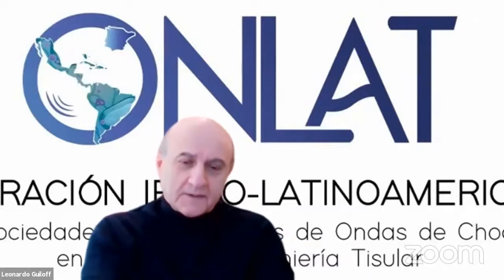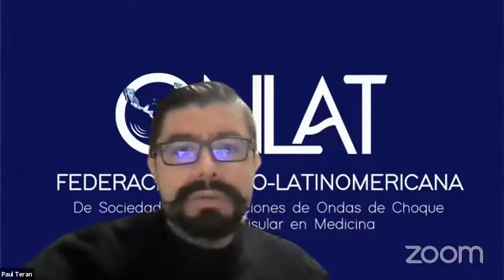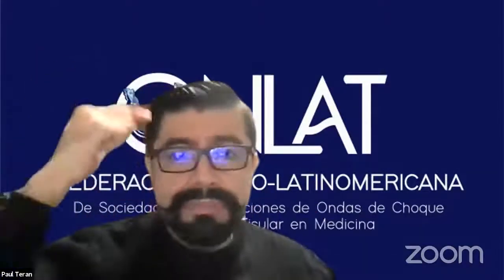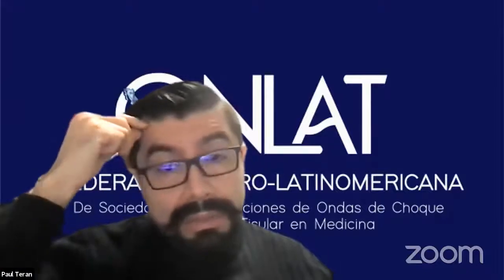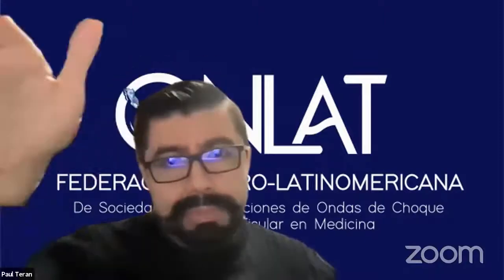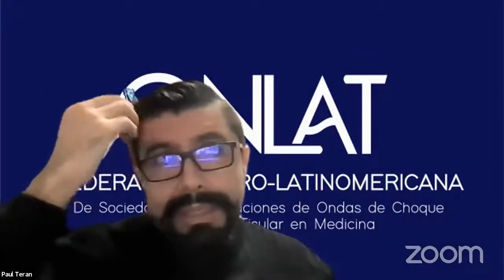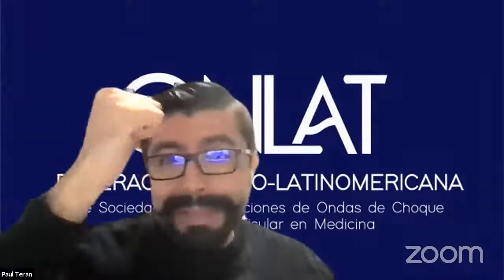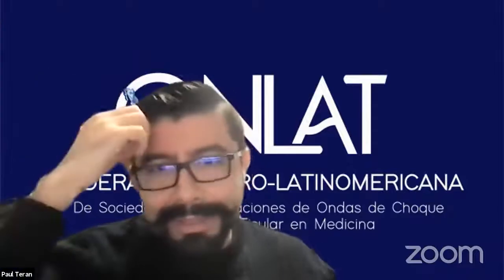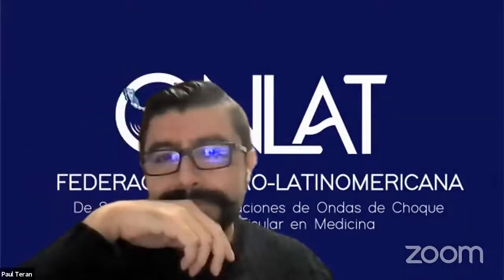What happened with your patients? We have seen many cases of little ruptures, or partial ruptures, of the patellar tendon with a bad application of shock waves. There are some published reviews, but the first cause is a bad technique for application of the shock waves. That's the first cause in all of the complications I can see in the patellar tendon.